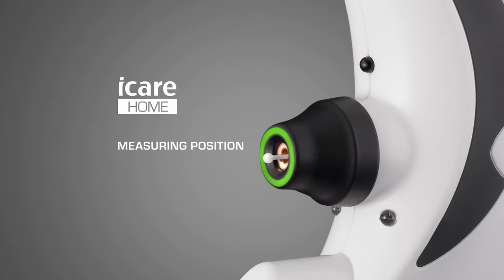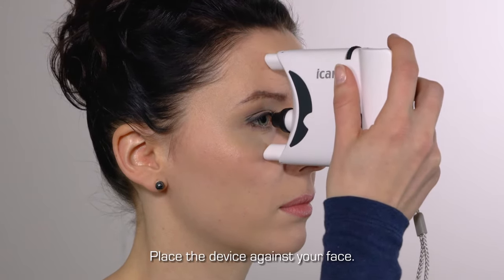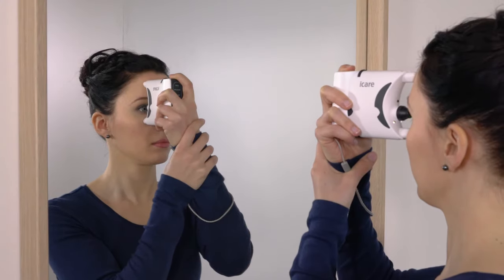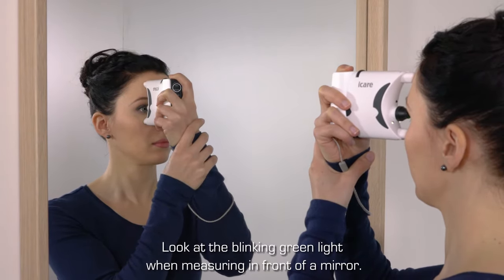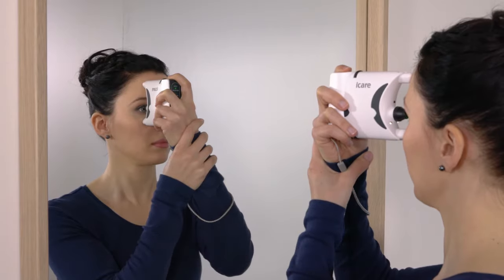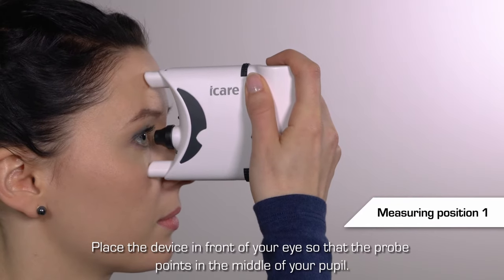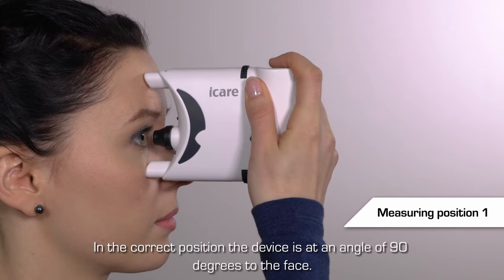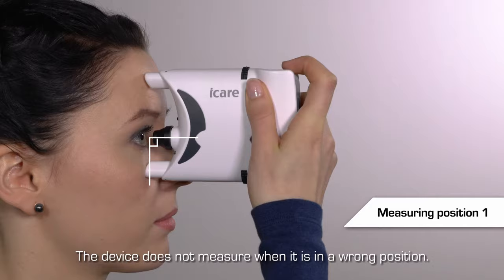Measuring position. You may be seated or standing. Place the tonometer against your face, holding it with one or both hands. Keep a good posture. Looking in a mirror can help with positioning — you can see the flashing arrow light in the mirror. Place the device in front of your eye so that the probe points at the middle of your pupil. You'll see a symmetric circle. Keep the tonometer at an angle of 90 degrees to the face. The device is in the correct position.